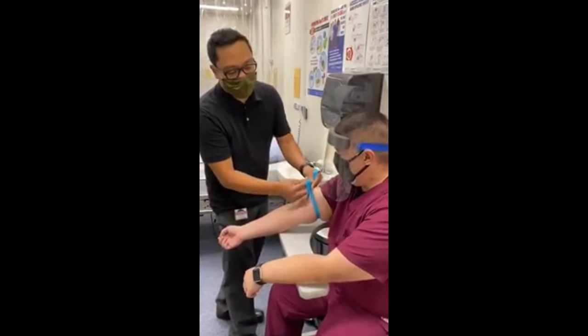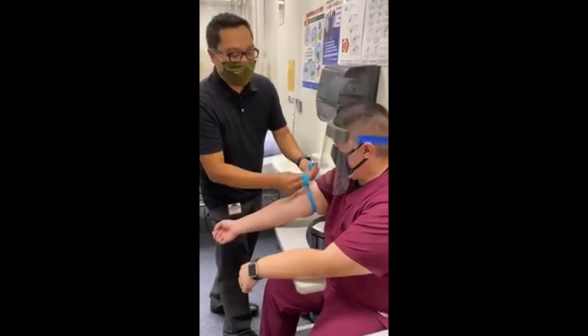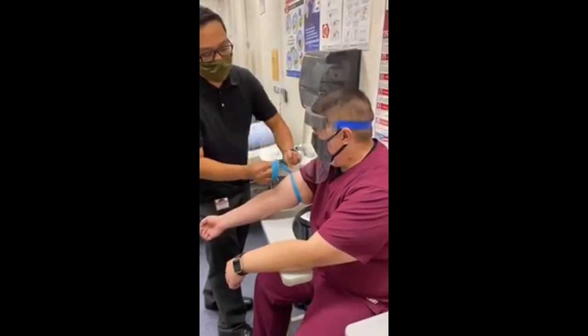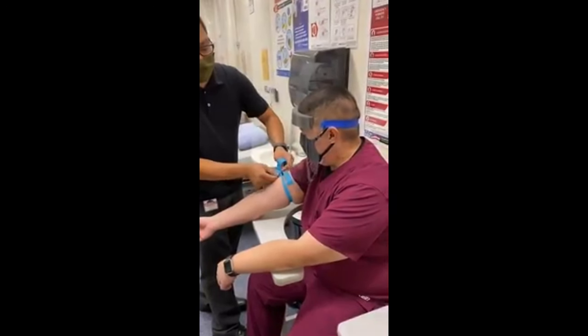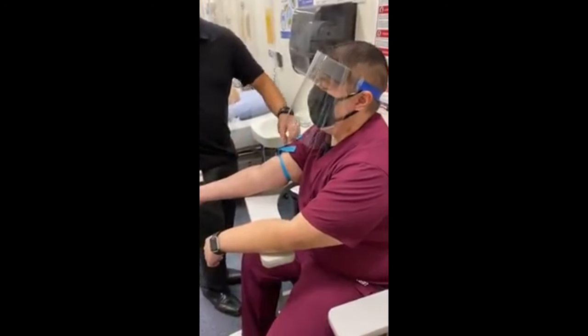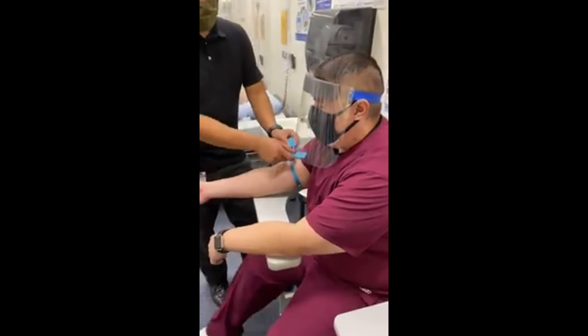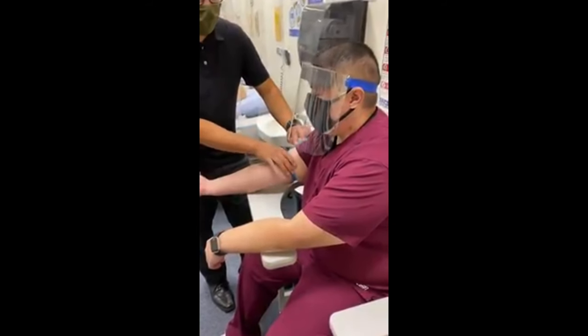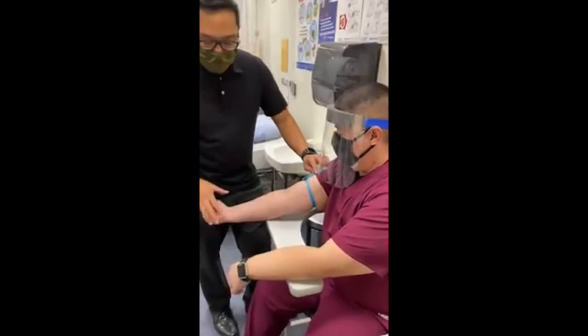Pretty much I'm going to cross. When I cross over, I can also create more tension or release tension. Pull more, pinch it with my other hand, then place it underneath, so you'll have the bunny ears. You want them facing upwards, not downwards towards the venipuncture site. And once it's on, I will tell them to make a fist.